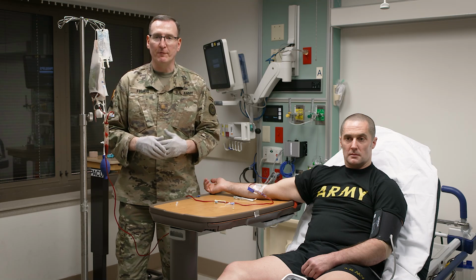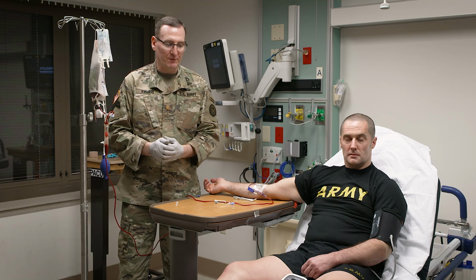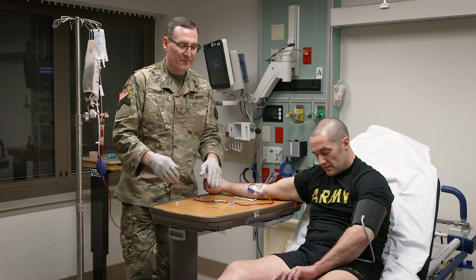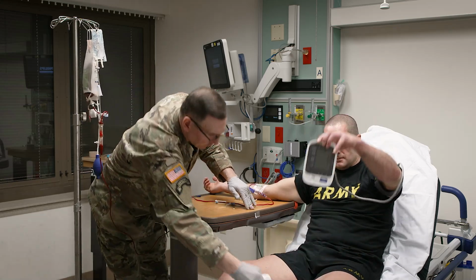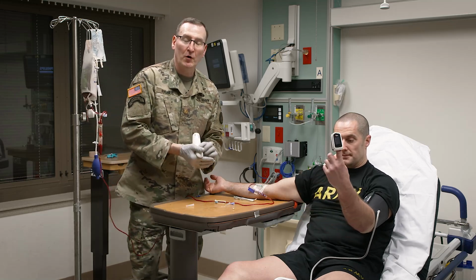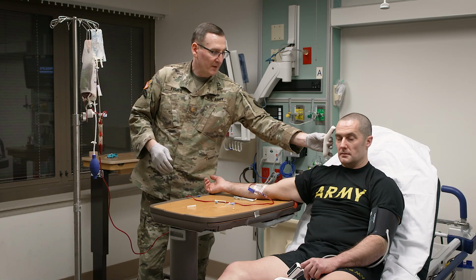All right, so it's now been a few minutes. I'm going to go ahead and get a set of vital signs to see how my patient's doing and make sure we don't have any sort of adverse events happening. So again, we're going to get a blood pressure. We're going to go ahead and place on a pulse oximeter that again will give us a pulse and SpO2. And I want to make sure I get a temperature.